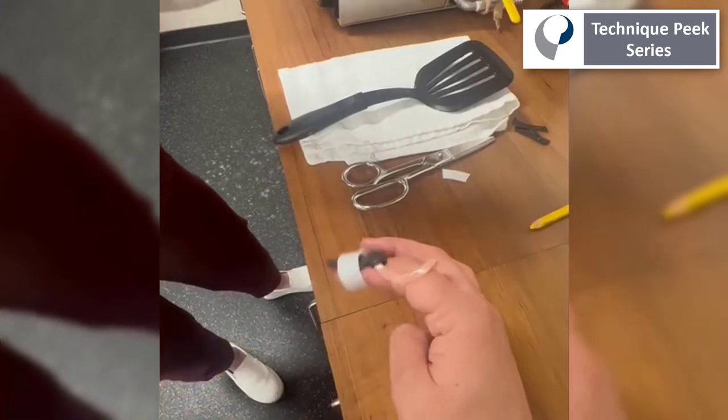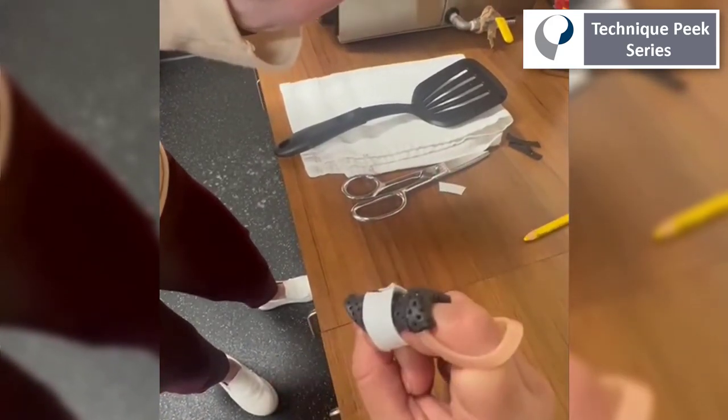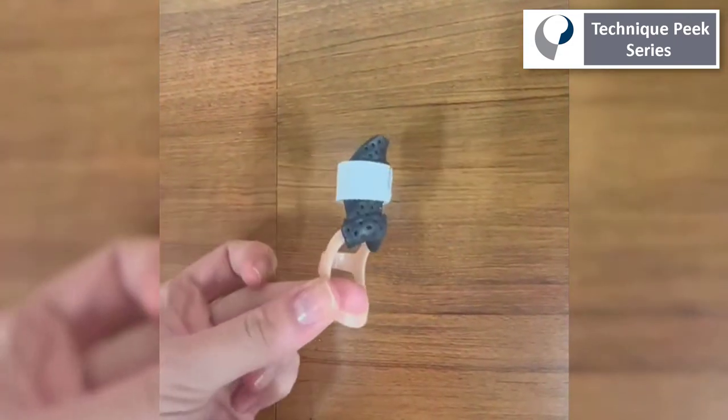This is a great, easy-to-create orthosis to prevent swan neck deformity. I hope you found this helpful and that you can use it in your practice.